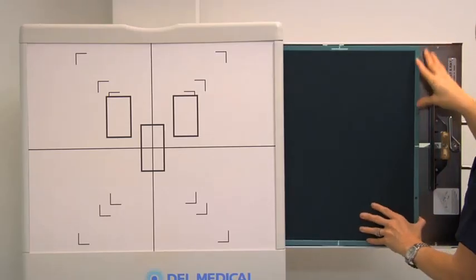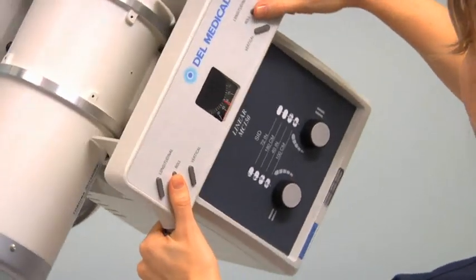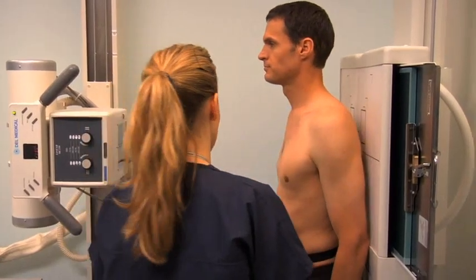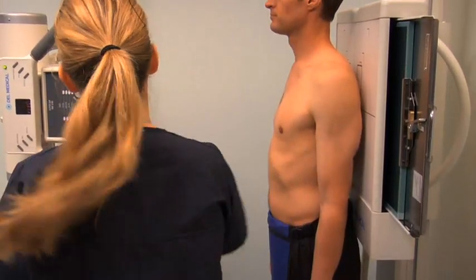To obtain a radiograph of the humerus in the AP projection, begin by selecting a 14-by-17-inch cassette and orientate it lengthwise in the upright bucky. Set the SID to 40 inches and align the central ray perpendicular to the image receptor. Select the upright bucky and the small focal spot. Set the exposure parameters to between 65 and 70 kV and 7 and 10 MAS. Ask the patient to stand in front of the image receptor with the posterior aspect of their humerus against the image receptor. Place a protective lead shield over their reproductive organs and move the affected arm slightly away from the body with the hand supinated.